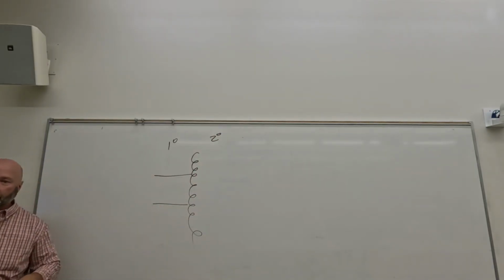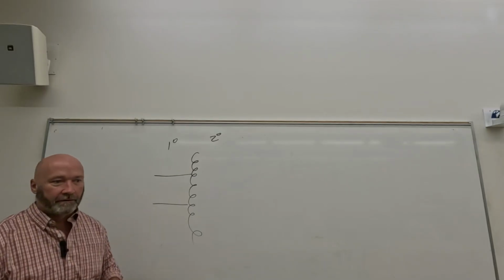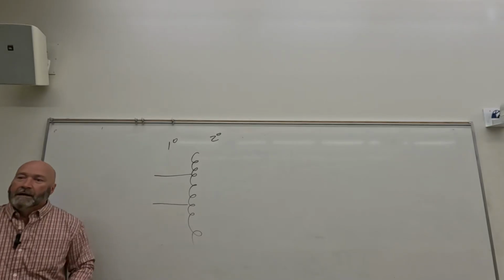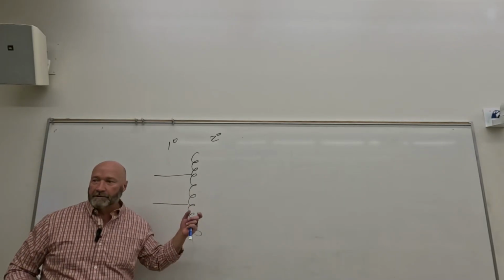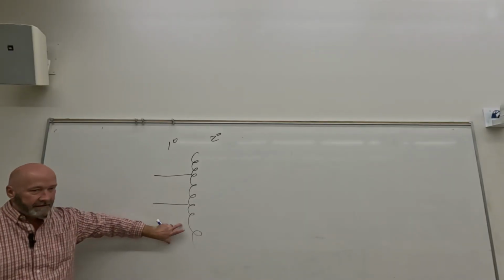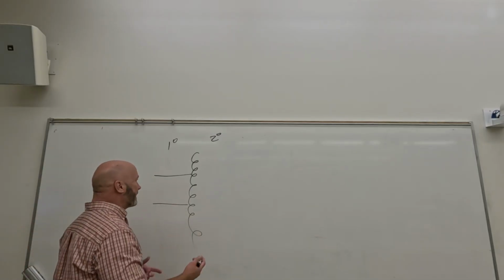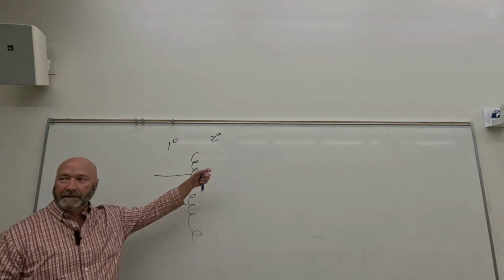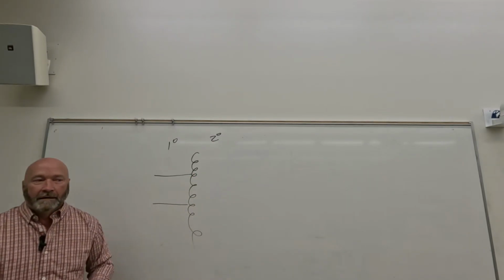If we spread them out, our voltage goes up. If we squeeze them together, the voltage goes down, right? So we can specifically set our voltage. So we feed it voltage over here, and we adjust, manipulate our voltage on the secondary side, right? So then this becomes our kVp selector, okay? So add that in, it's our kVp selector, and we select kVp by adjusting the contacts on the secondary side of the auto transformer, right?